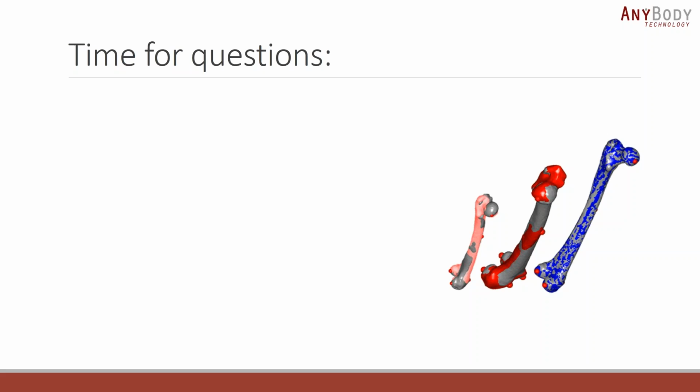Yes, we have, of course, tried to scale very thin bones, and we work on the pelvis. If you remember, I talked about the pipeline of transformations, and the second last being STL to STL morphing transformation.